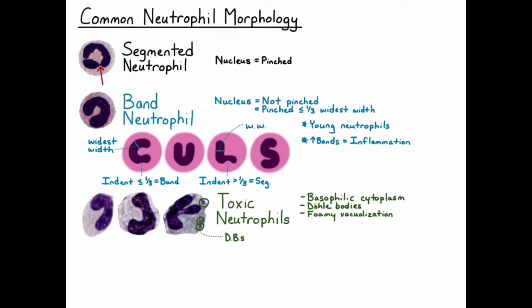These are dense blue aggregates within the cytoplasm, and they represent aggregates of retained rough endoplasmic reticulum.